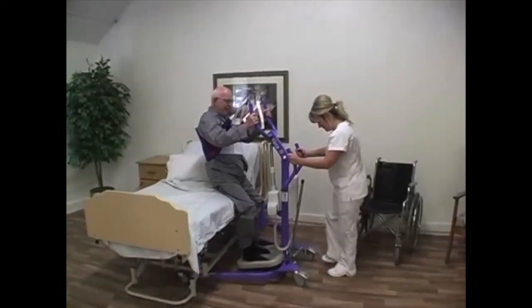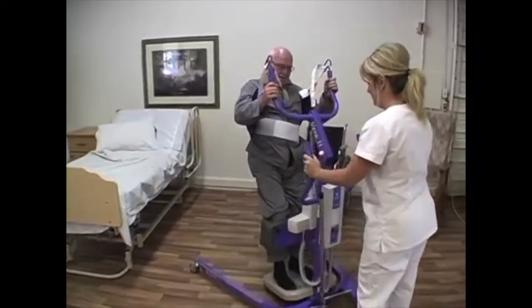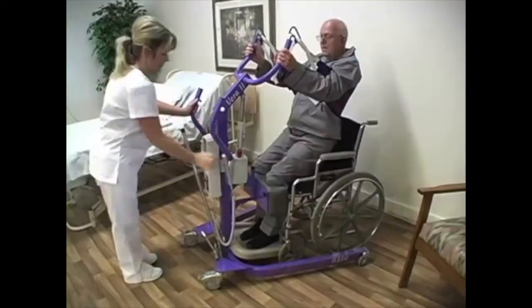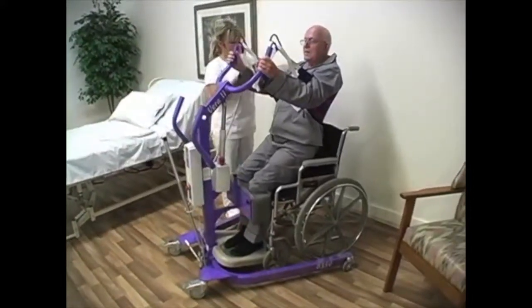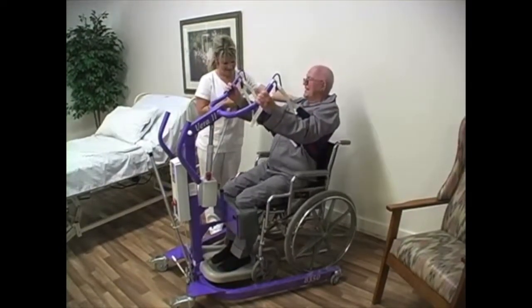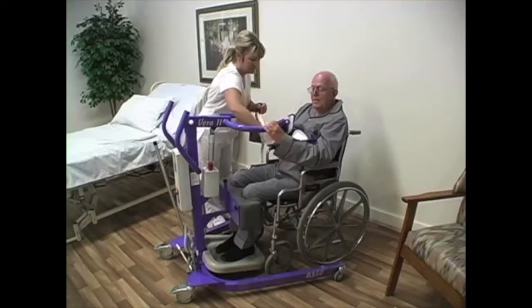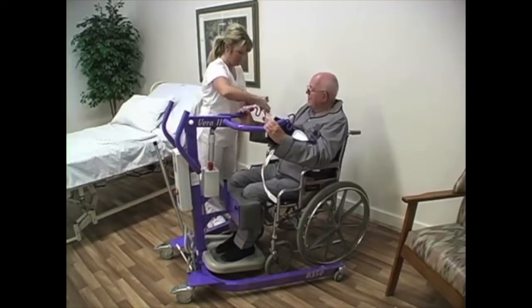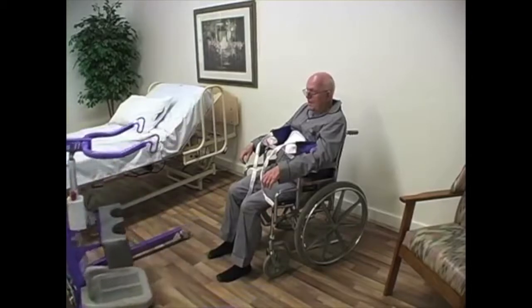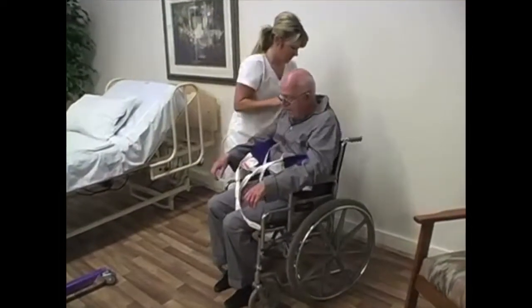Unlock the brakes and back the client away from the bed. Slowly turning the lift, move the client over the wheelchair. Move beside the client and lower the client until his or her buttocks are against the backrest. Unhook the back belt loops from the lift arm hooks. Back the lift away. Unfasten the safety belt and remove the back belt.